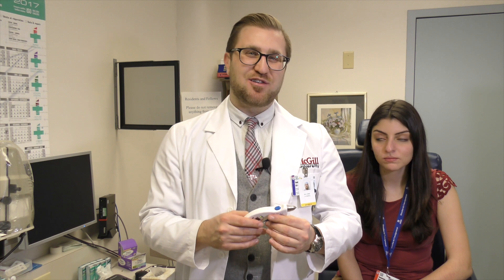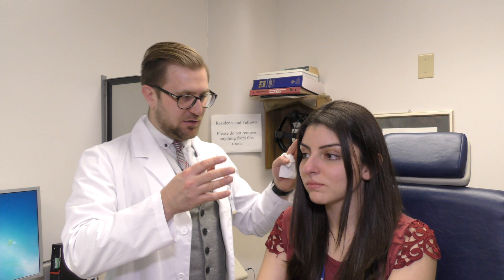Now I'm going to show you how to get the patient ready and test the intraocular pressure. I have our medical student Sumaya as the patient today. When you begin your tonopen assessment, make sure the patient is sitting comfortably, head up straight, looking in the distance. This is very important because when you approach the eye with the tonopen tip, you want to touch the cornea right in the center along the visual axis to get the most accurate measurement of intraocular pressure.